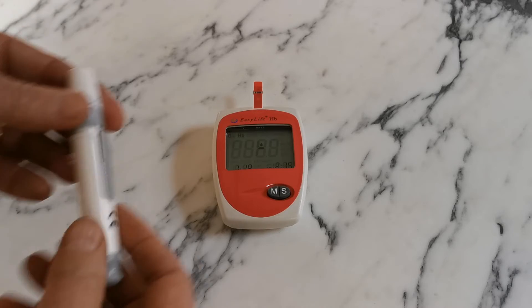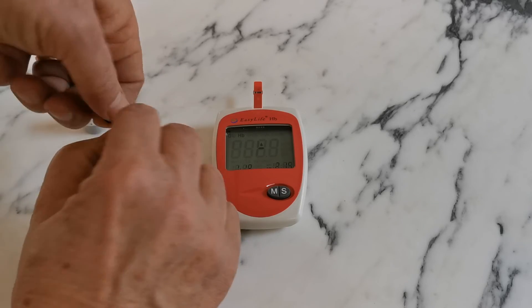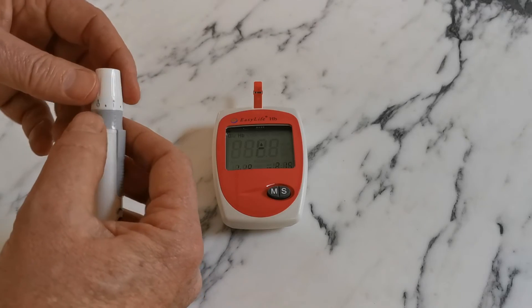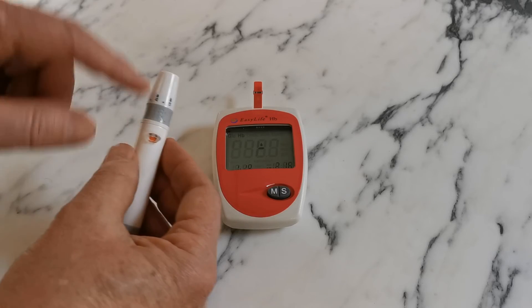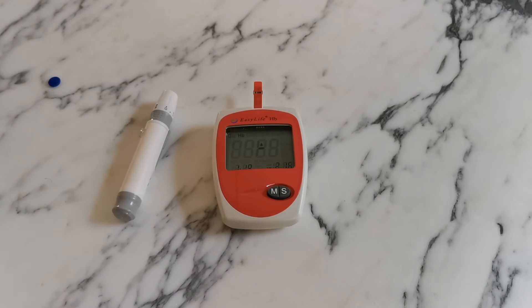Take the lancing device, insert a clean fresh lancet into the top, and remove the plastic cap by twisting it, then reattach the rotating cap. Rotate the very tip of the lancing device to set a predetermined depth level — on this auto lance that's between one (shallow) and five (deep). When starting to test, we recommend using a deep lance initially until you find out how well you bleed, as a good sample collection is key to getting accurate haemoglobin results.